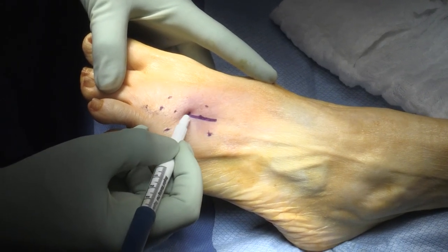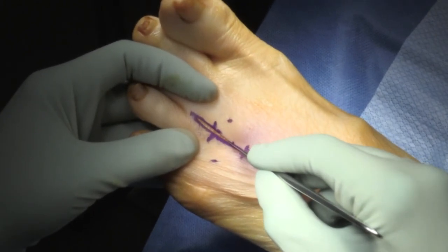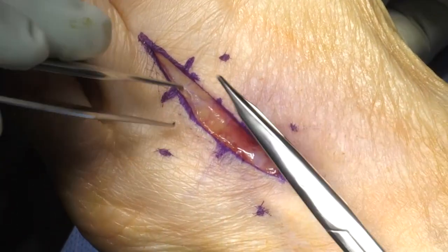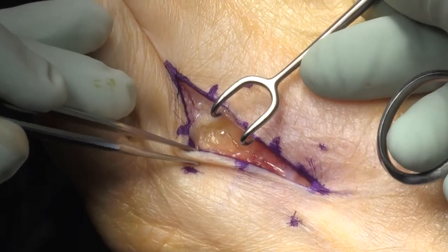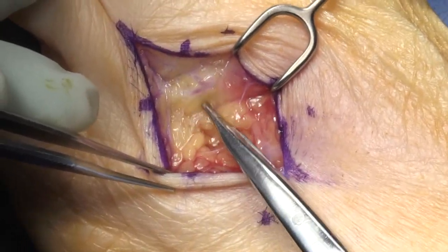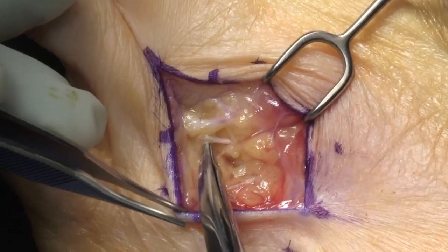One thing that Jeff has emphasized is just making the incision. In all the videos that Andrew and I have produced, that is something really key to a good result — peroneal nerve release at the knee. If the incision is proximal, you're not going to find the peroneal nerve. So I really liked Jeff's clarity of how to make that incision. Now we're using these little skin hooks and Fischer tenotomy scissors. Those scissors are super for manipulating nerves safely. They're very smooth on the outside and are sent out to be sharpened appropriately by the company that makes the scissors.